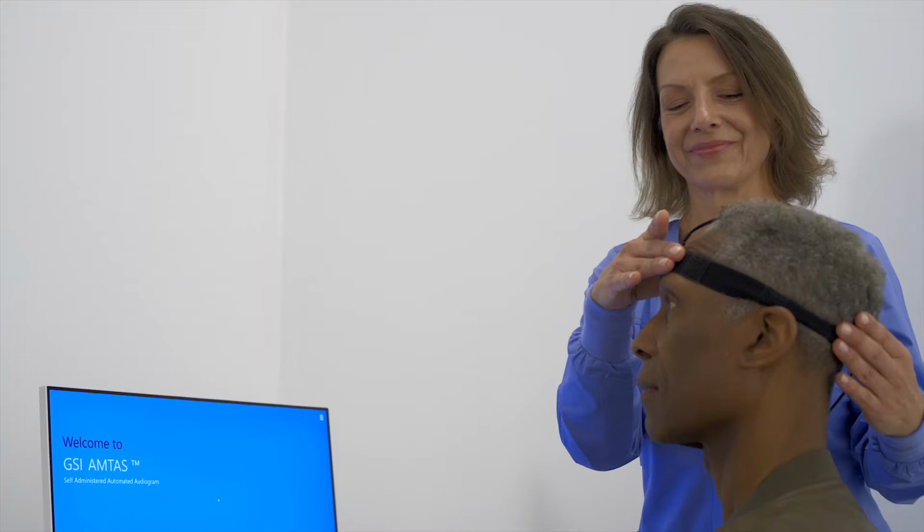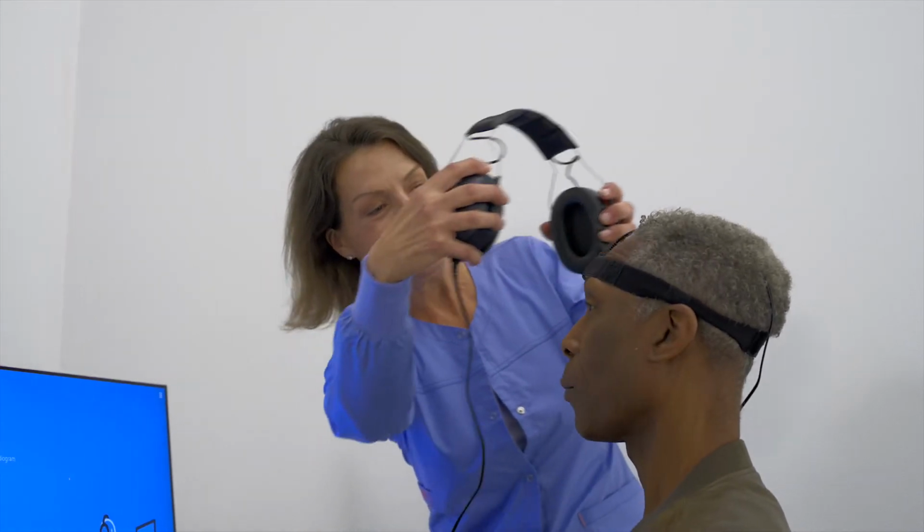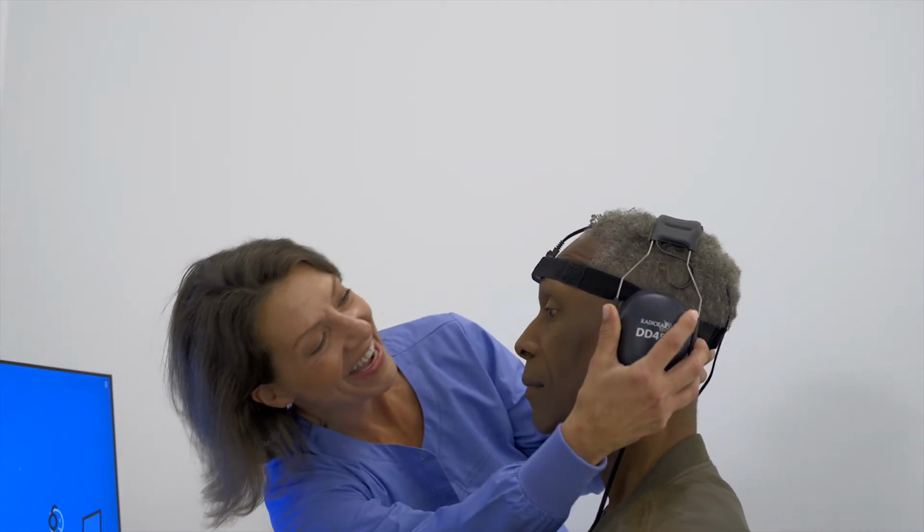Once the patient understands what to do, place the AMBAND headband around the patient's head and ensure that it is in the center of the forehead. Then slide the bone oscillator under the AMBAND so that the round part of the transducer is in the middle of the patient's forehead. When the bone oscillator is secure, place the circumaural headphones over the patient's ears, making sure both ears are within the center part of each ear cup.